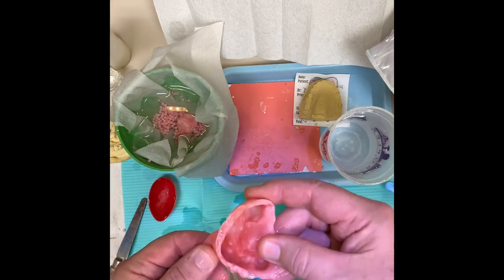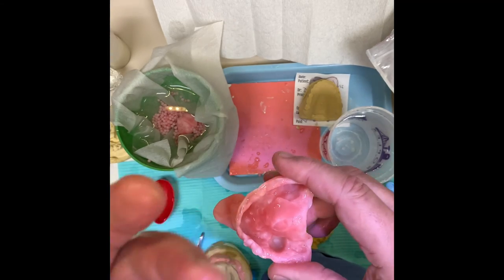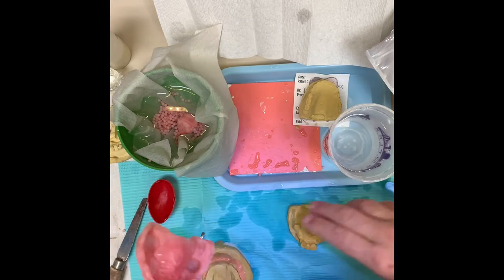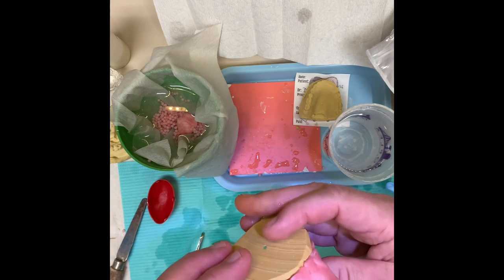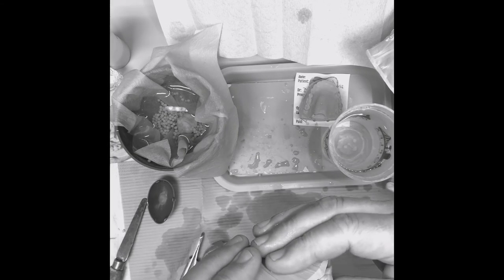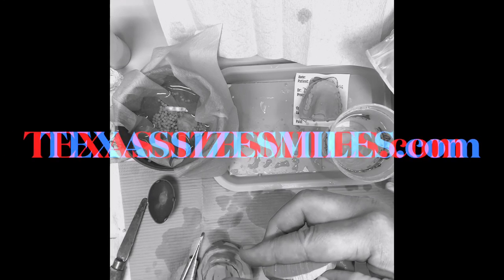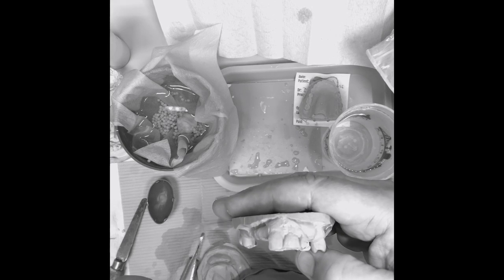Voila, you have a custom impression tray. What's cool about this is it's hard, so when you go to the patient's mouth it'll go right in and up underneath the vestibule really well. You can see how important it was to trim the front of this off - look how far that's going up under that lip compared to where that model would have ended if I hadn't exposed where all that impression material had squirted up underneath that tight lip.